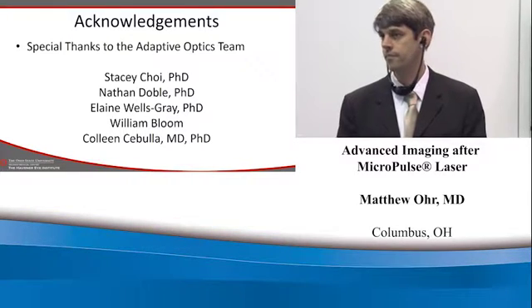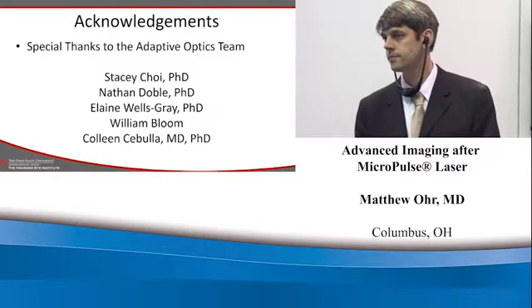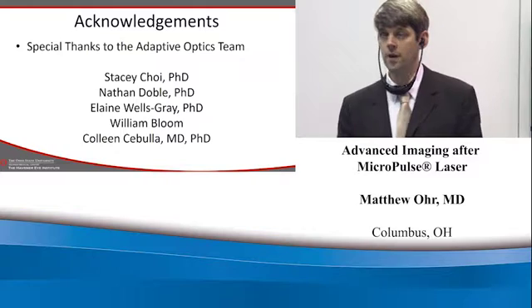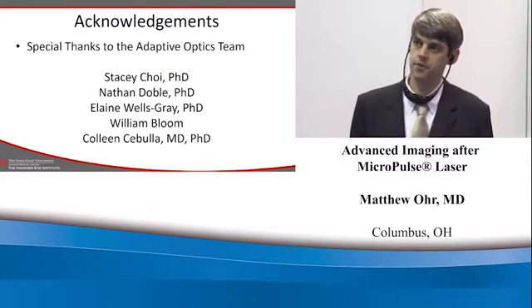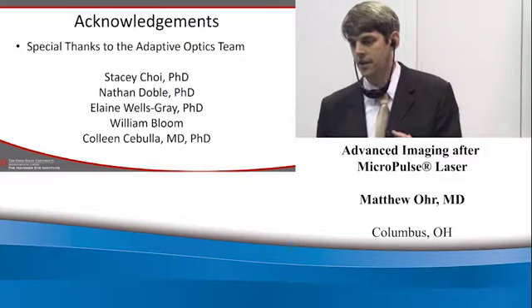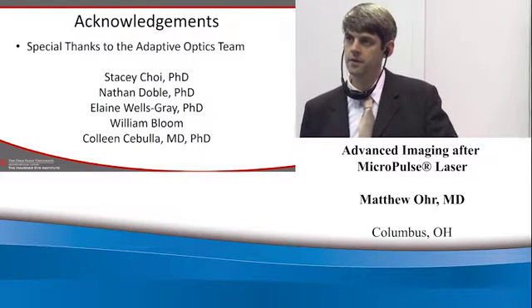Do you have any pictures of the area of treatment or the fovea? I don't. And how long would you wait before you see any changes after the laser that it has worked? What's the timeline? I still go by the 3-month effect that we use for standard focal in terms of waiting for the focal treatment to change. But of course that's a variable target as well, because if they come in and their vision's getting worse and the edema is getting worse, I'm not going to wait 3 months to inject or do something different. That would be patient dependent.